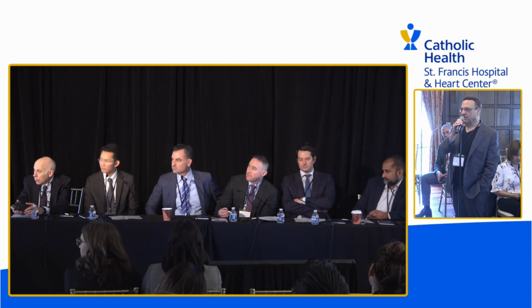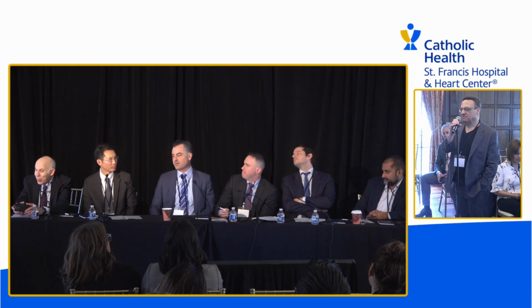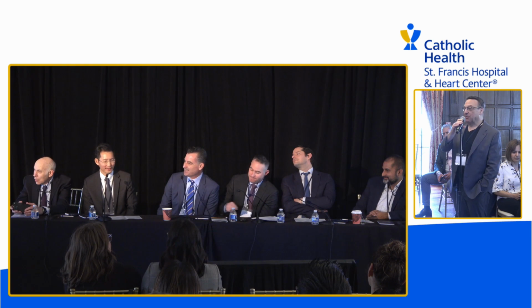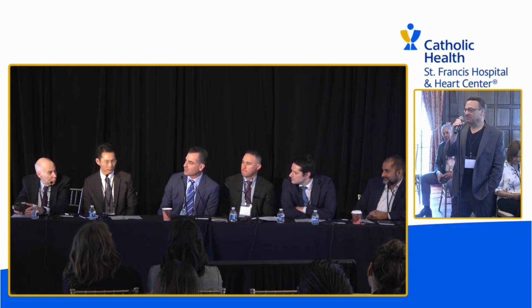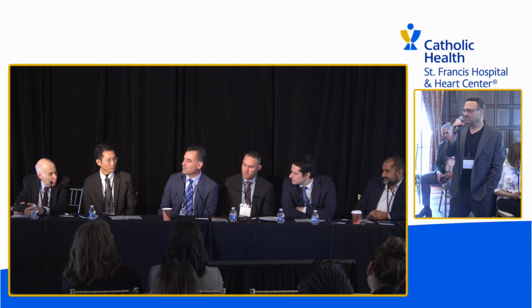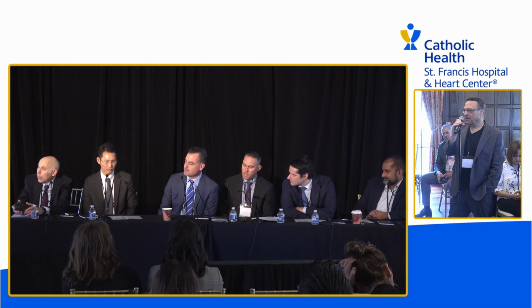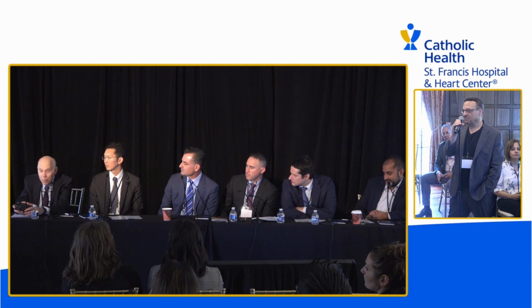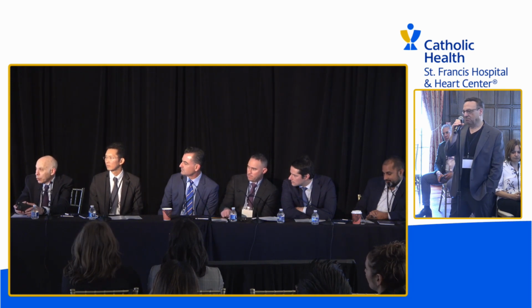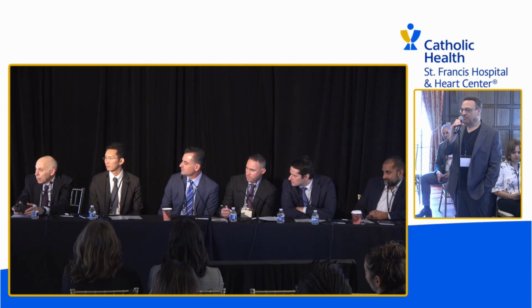Do you ever do an Alfieri in these cases? Alfieri is pretty much in the preserve of Dr. Chung and Dr. Berkey these days. But for me, a quick mitral ring in a younger, low-risk patient would be an easy thing to do with not much downside, and that would probably be my bias if I felt that they had enough MR to justify doing a double valve procedure. Plus, after the aortic valve is treated, either way, the patient's going to likely be on more medication, so that may help with some of the mitral.